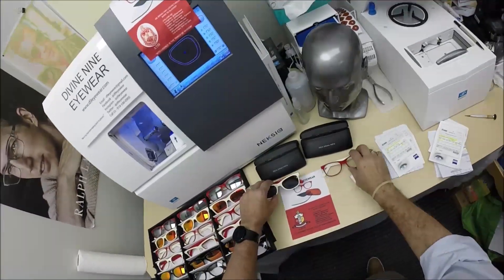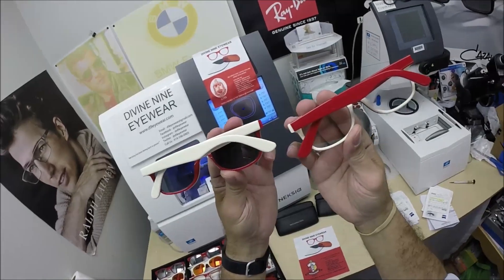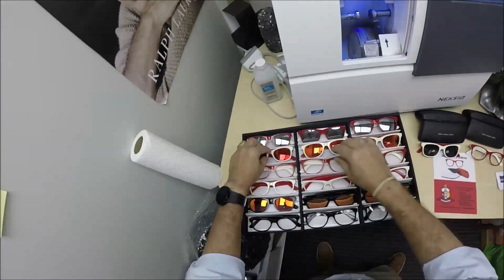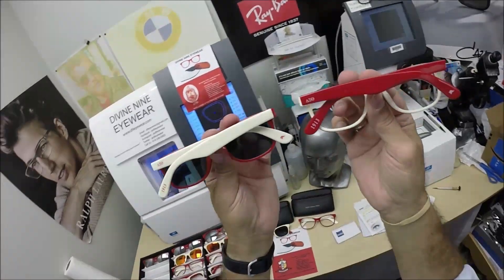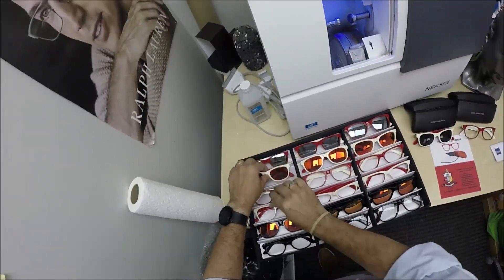She did something I've never had a request for before: she wanted no printing on the outside of her frame, so I removed that. They normally come with Delta Sigma Theta, the 1913, and the Elephant on the outside, but I was able to remove all of that at her request.